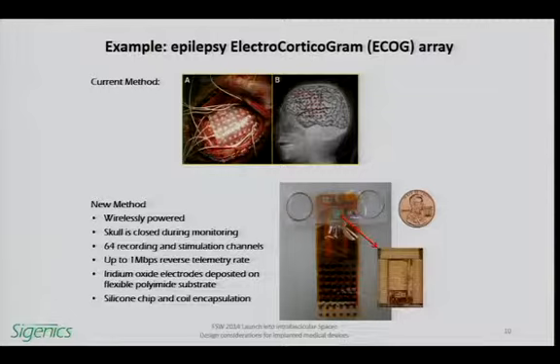So can the electrical activity that you measure on a patient be used to study what's happening with the patient outside of your chip? Oh, it can indeed. That, in fact, is part of the intended purpose globally of this type of device. They're doing it now using wired electrode arrays, but the wires have to come out through a hole in someone's skull for several weeks while they undergo this process. So we're trying to improve that process.